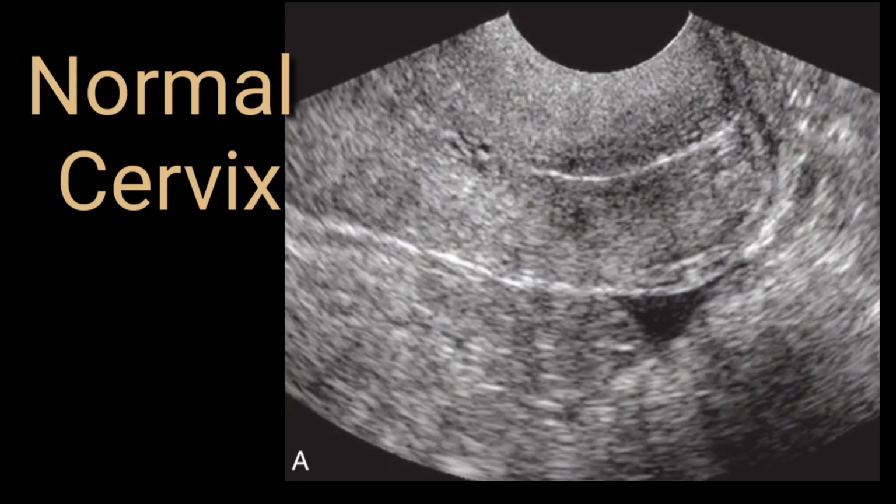Now it is time to look for the cervix and the Nabothian cyst. So how it will appear on the ultrasound images, let's start watching this radiological anatomy of the cervix. Have a look for the cervix on this transvaginal scan. Uterus is normal. Half of the body of the uterus can be seen on this image, but basically focus has been given to have a look for the cervical area.